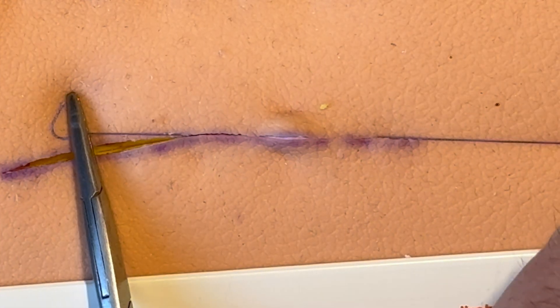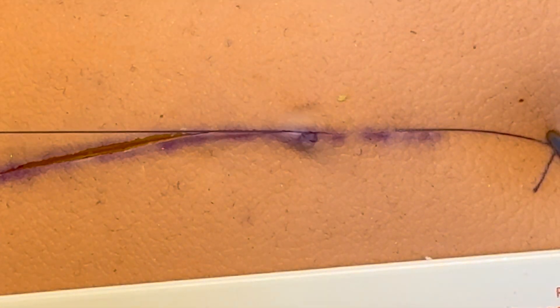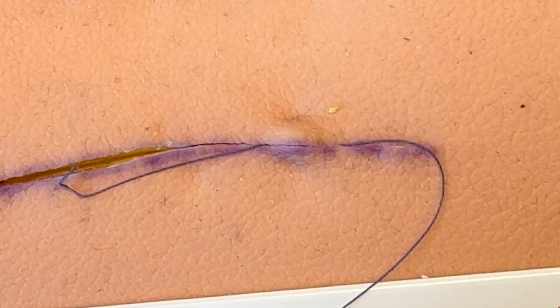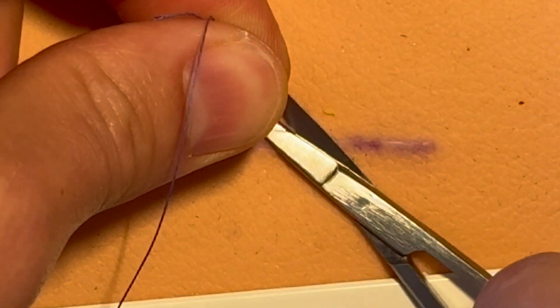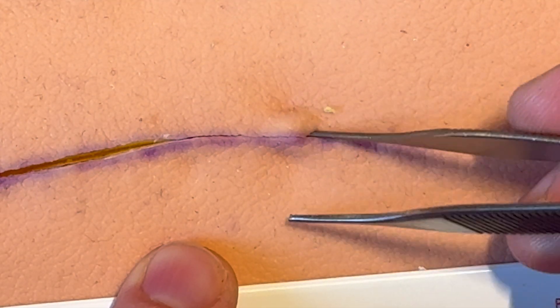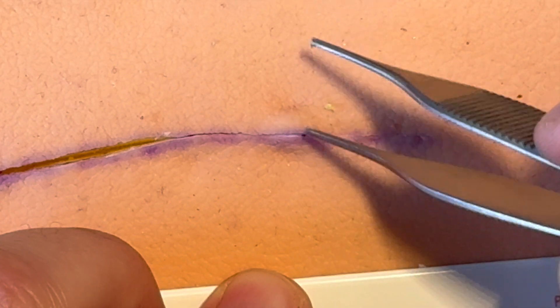Even though this isn't real skin, it does happen like that in real skin quite often. You can give it a little tease to get it where you want it. Sometimes the edges are just not quite aligned — you can use either the tip of the forceps like a skin hook, or use the skin hook and just ping it up a little bit to release it and get it in a nicer position.